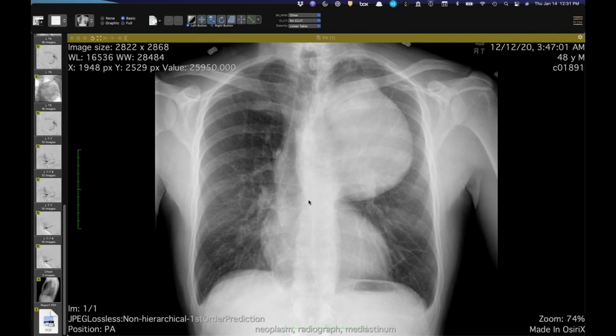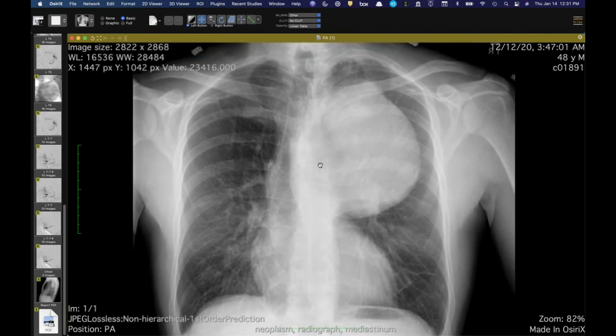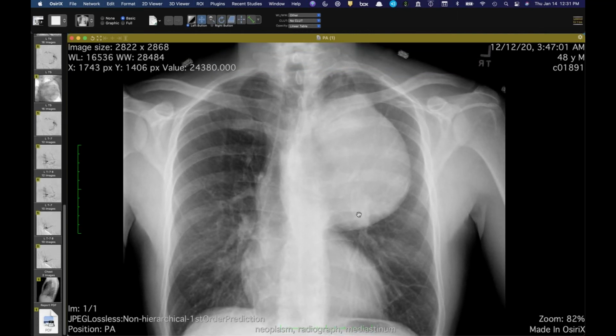So anyways, Jeff, those are my cases. Awesome, thanks. All right, Travis, you wanted to go. Let me make you the presenter. I'll just show one case. Howard, I waited for you to come back to show this one since I was going to show it last week.